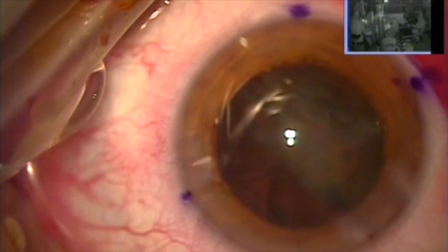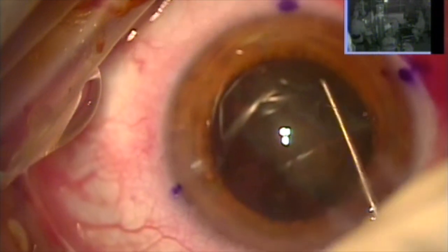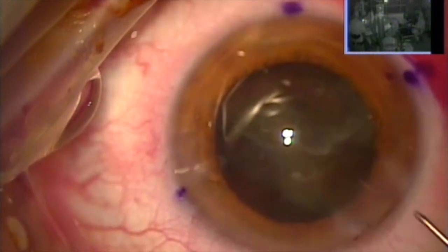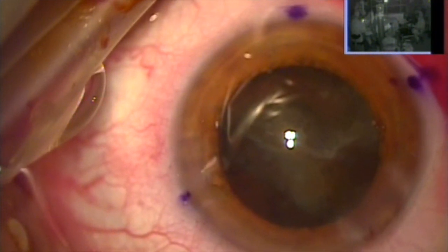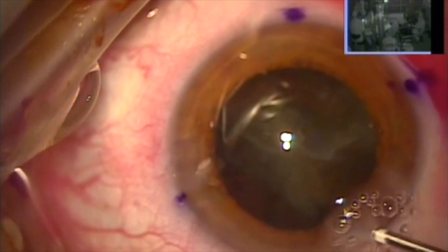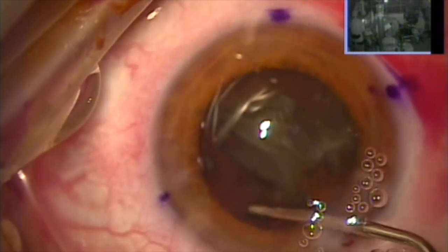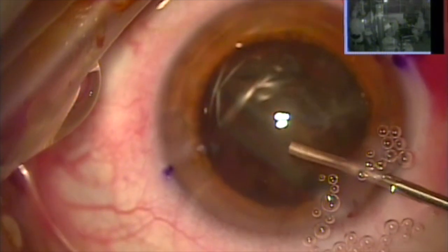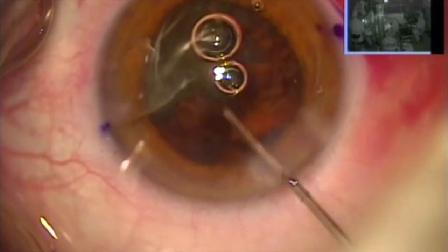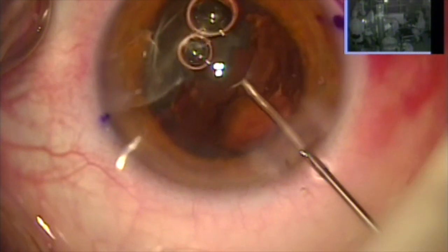So the stakes are high. I invariably pause very often to re-instill Viscoat. I'm using my hook to bring up this large hemi-quadrant of the cataract. I'm going to use my leisure time here to place Viscoat under the lens and thus reduce the stress on the capsule bag and also protect my cornea and the endothelium. You can see here how careful I am — this is the second tube of Viscoat in this specific patient, but well worth it.